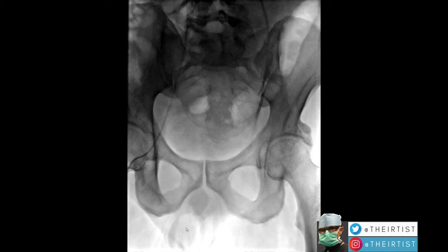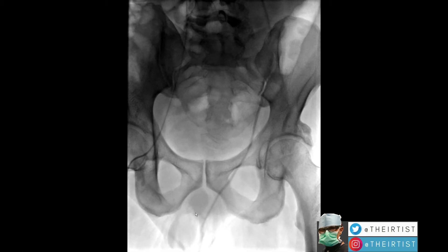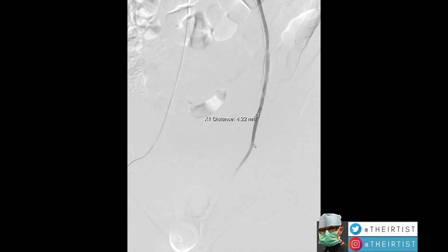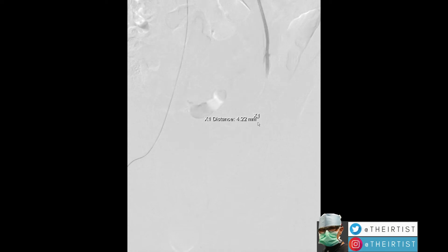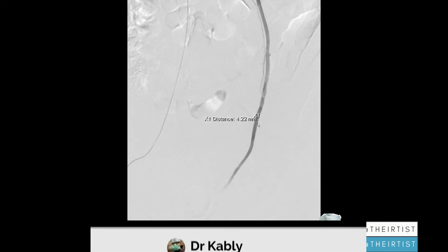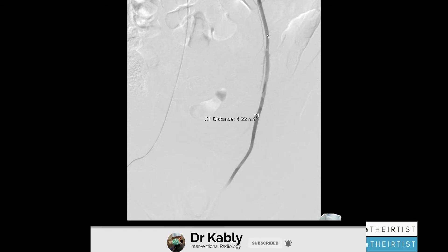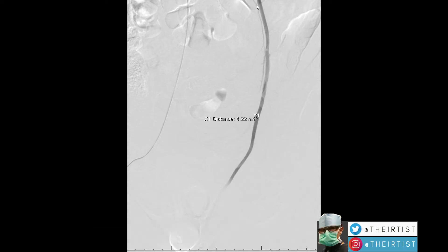This is the left testicle, this is the right testicle, and this is the penis of the patient. Once we visualize it, we can do a whole range of measurements and assess the most adequate location for the embolization. This is the advantage of radiology over surgery — we can see the collaterals, which are the small veins attached to the main spermatic or gonadal vein.